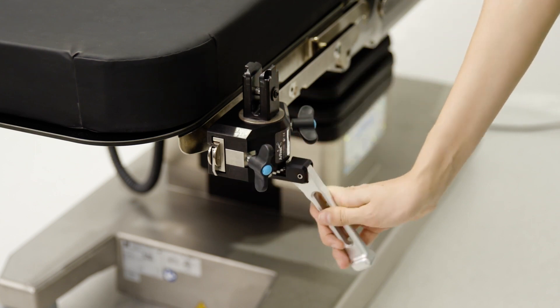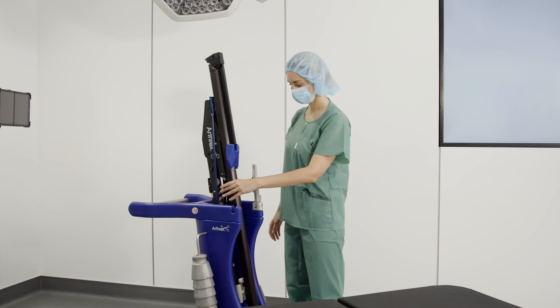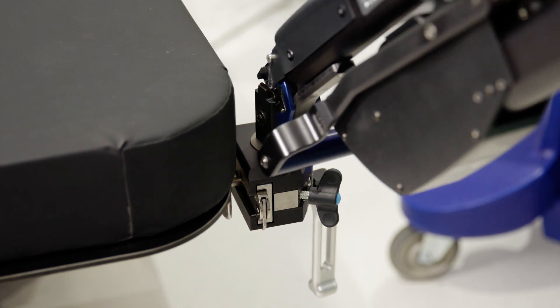Lift the longer lever to change the forward flexion adjustment. Dock the base of the tower into the rail clamp by using the handles and approaching the rail clamp at a slight angle.